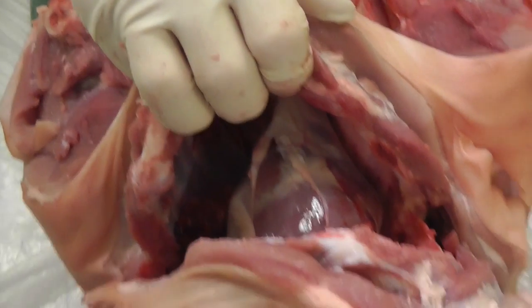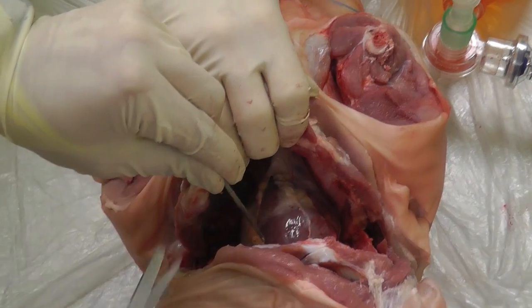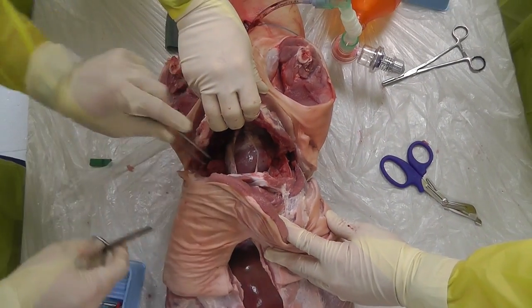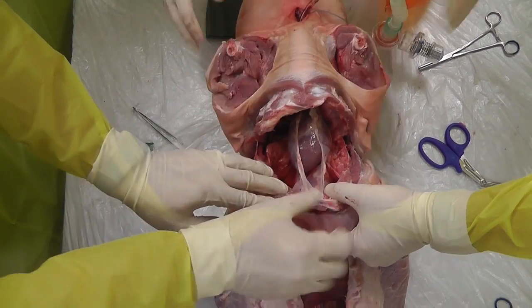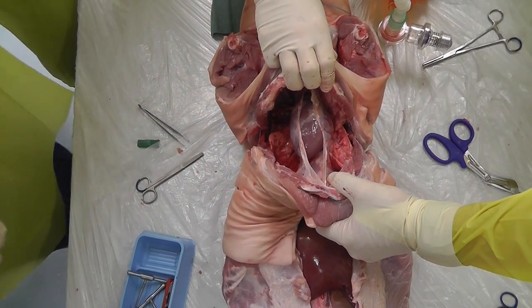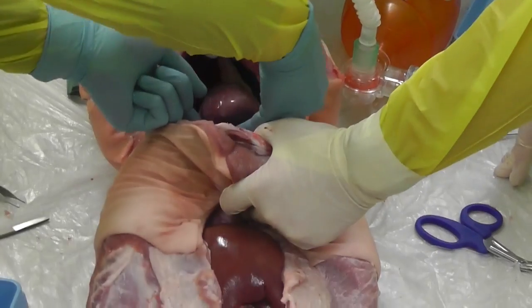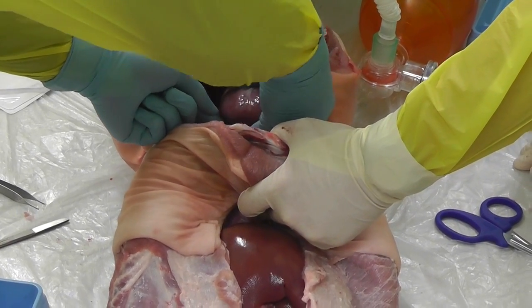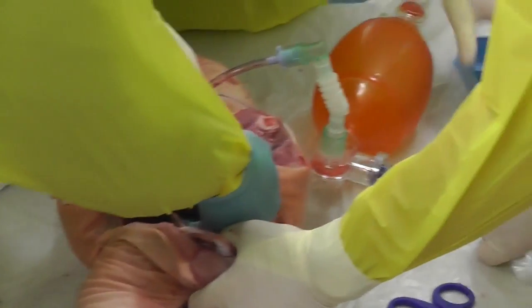In the human, you are going to pick up that pericardium, make a cut, then put your scissors through and go vertically up and down — that gives you good exposure. Deliver that heart and inspect all sides of it. If you kink it up too much, all those great vessels at the top are going to be clamped off so there will be no flow. You can see how potentially you can visualise the posterior segment from this position.